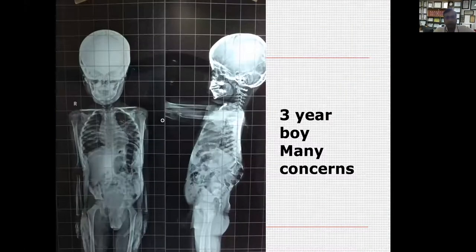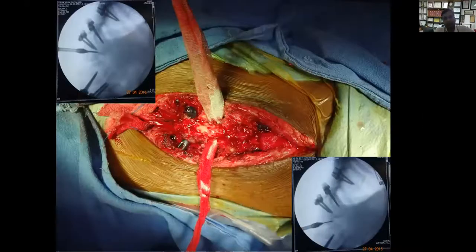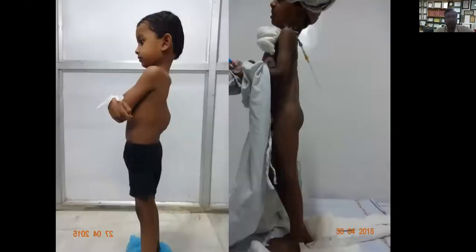This was a 3-year-old boy where we had many concerns because the whole blood volume is just less than 1 liter or 1.2 liters in this age group. And we know that this child needs a vertebral column resection. When we did the vertebral column resection using this ultrasonic scalpel, you can see the scalpel in the intraoperative x-rays. The whole blood loss was less than 400 ml in the whole surgery in this child.